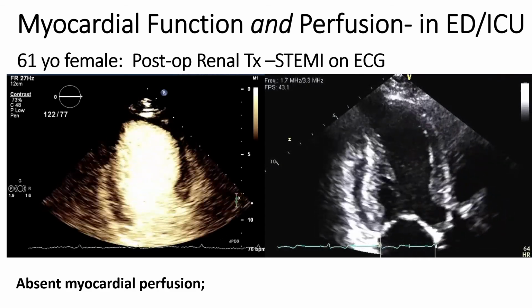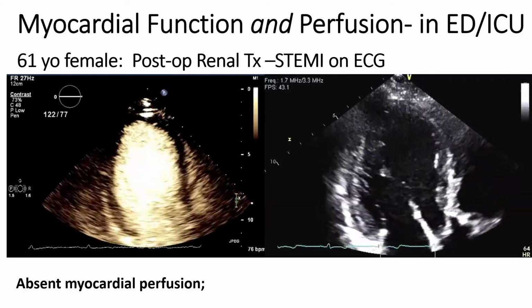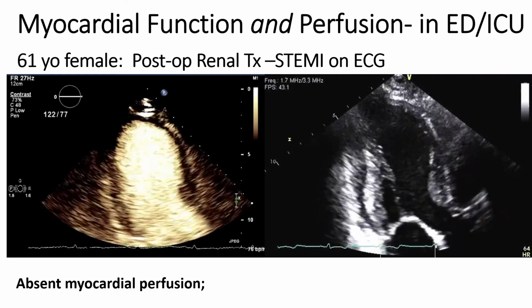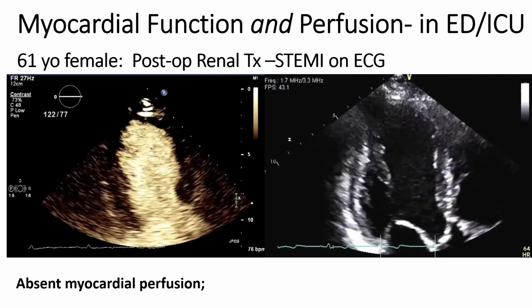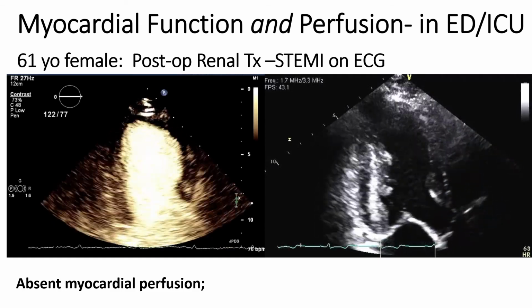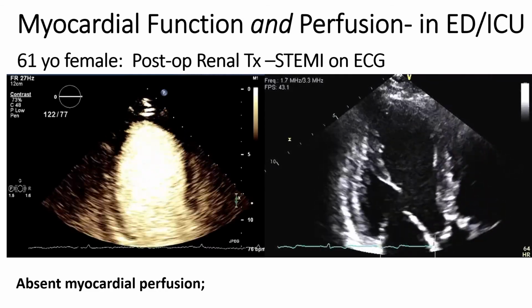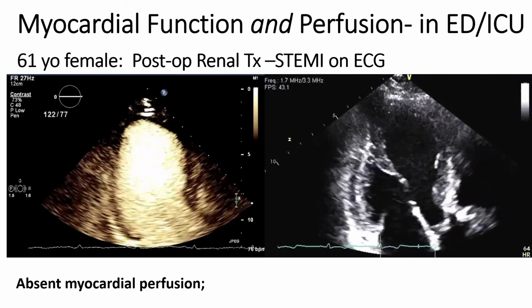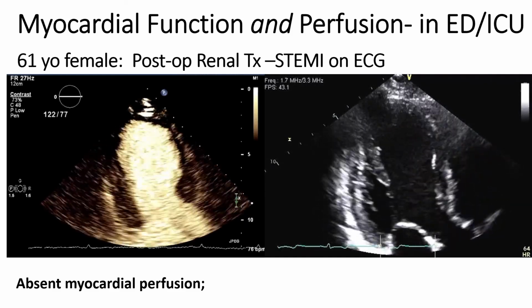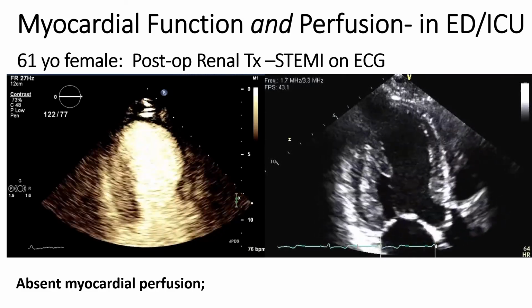In her perfusion echocardiogram, as you can see here on the left, after the high mechanical index flash there is a very, very black area where the wall motion abnormality extends from the proximal anteroseptum. Again, this is an apical long axis view, extending all the way around the apex and into the inferolateral wall. Now, the point is that there's no evidence of microbubbles in this akinetic segment. So one would think that this is most consistent with infarction in this area. And indeed, she did go to the cath lab. She was found to have a subtotal proximal LAD stenosis, and this was stented.